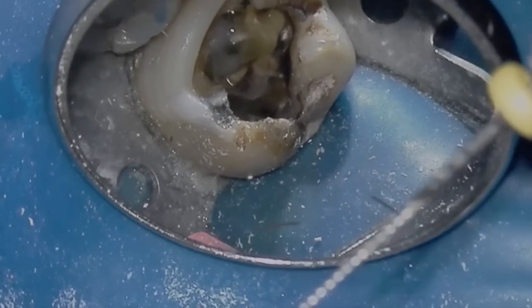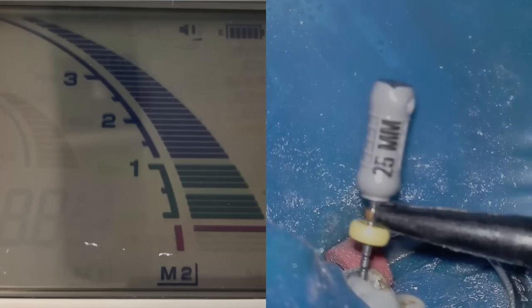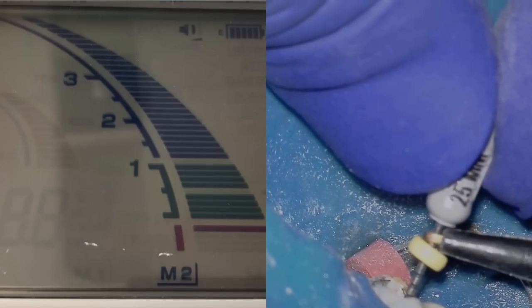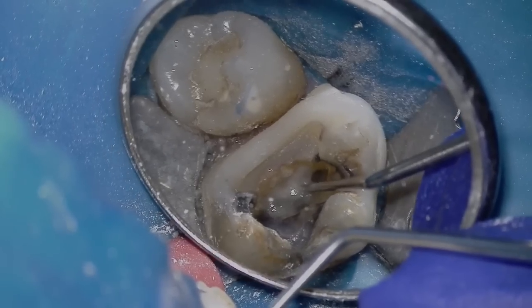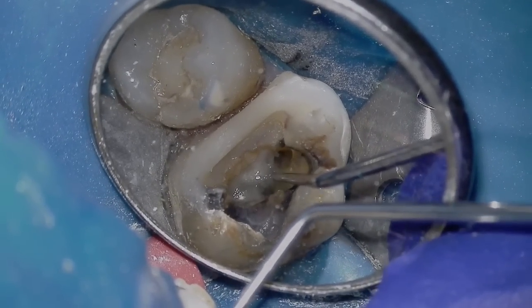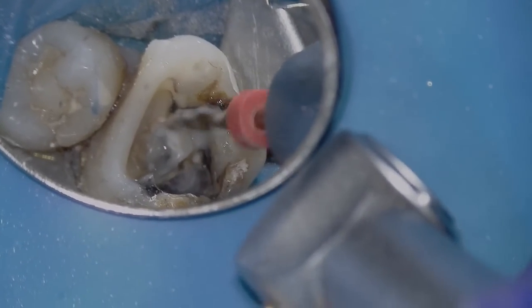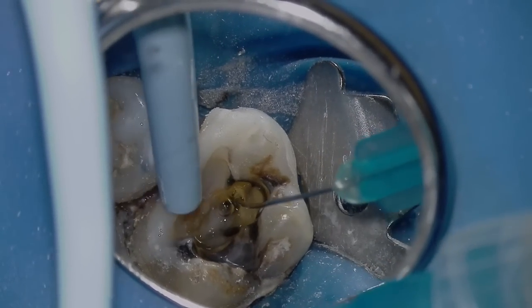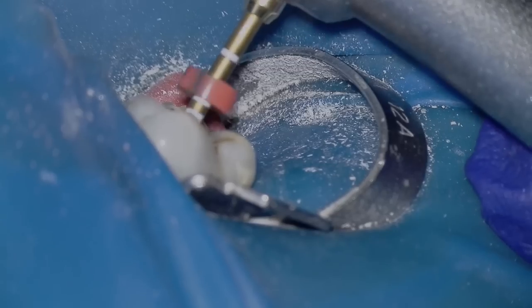This tooth was pretty straightforward, so I just used a 6, 8, 10 file to get working length. On the apex locator, what I'm looking for is one red bar and I subtract 0.5 millimeters from that. I know you're all curious where MB2 is — I'm asking the same question. Because it's not readily available and I can't place a file in it right now, I'm going to clean and shape MB1, distal buccal, and palatal first, then tackle MB2 once those are all clean and shaped.